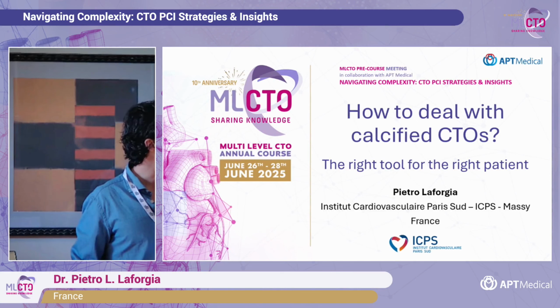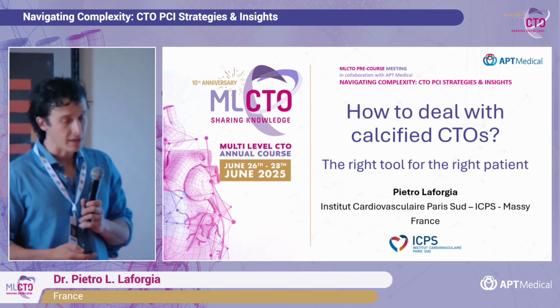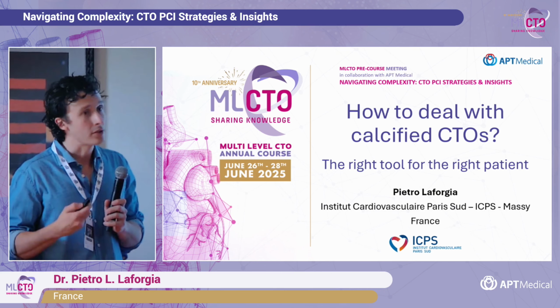I work in Massy in France, close to Paris, and we will start by talking a little bit about calcified CTOs, and what we need to succeed in calcified complex CTOs, especially for relatively young operators like me. The most important thing is, of course, to succeed, but to stick with your plan, to decide what material you want to use, try to use your material as much as possible and be able to succeed the most. Of course, we all know what the challenges in calcified CTOs are.